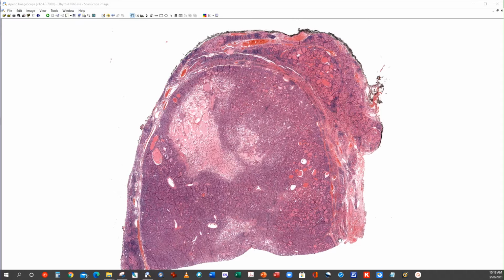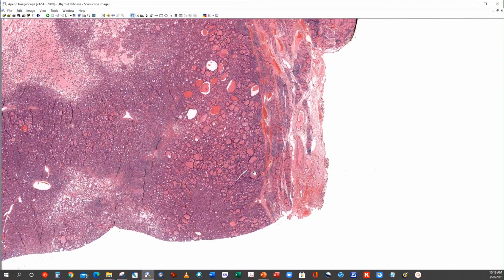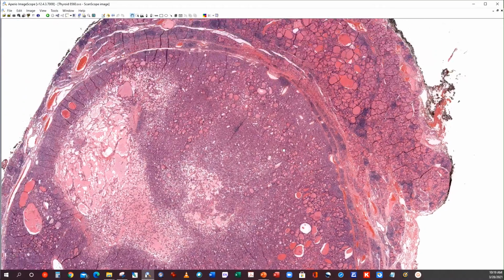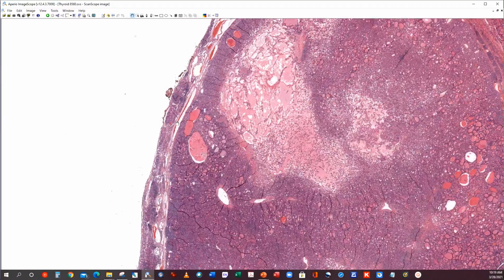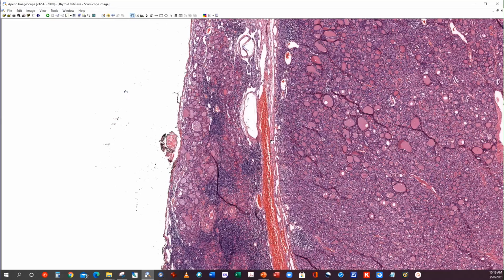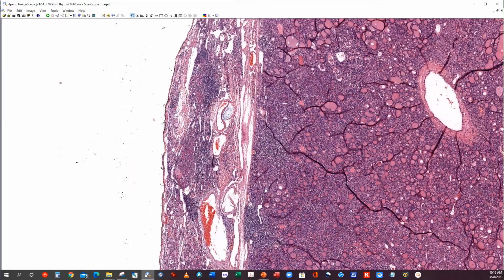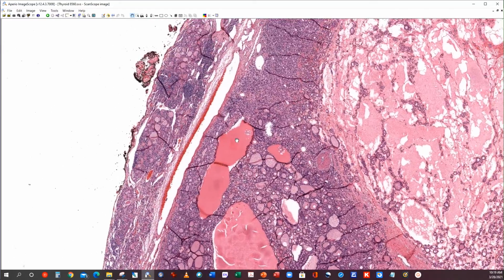You will notice that there is a very well delimited representation to this nodule. There is a background of small adenomatoid nodules as well as chronic lymphocytic thyroiditis. However, as you look at this particular nodule, I think you will see a very well demarcated area that provides a separation from this tumor and the adjacent parenchyma. The capsule is present, albeit somewhat thin in areas, but it is still immediately identifiable as you go around the entire periphery of this lesion.